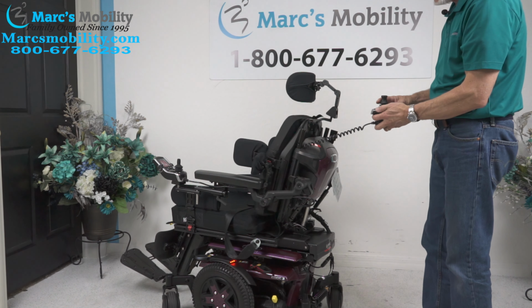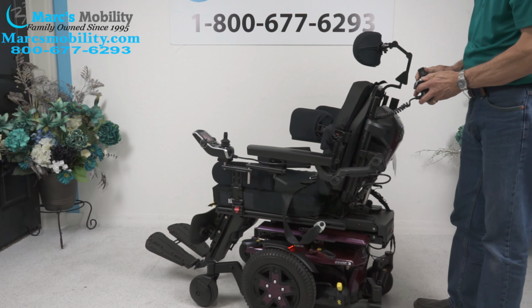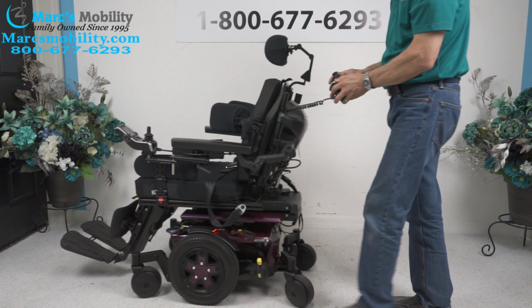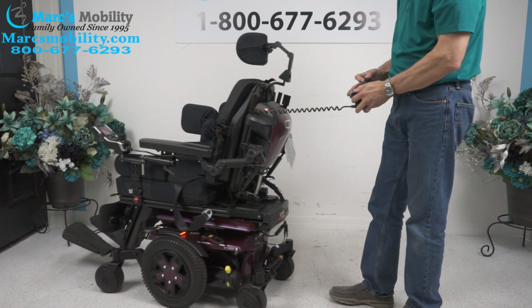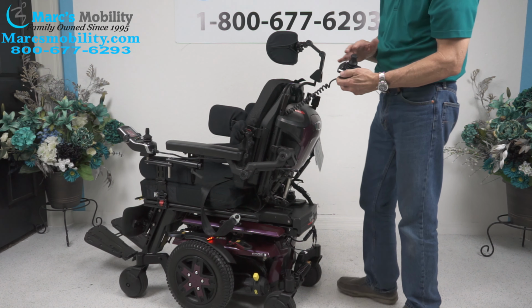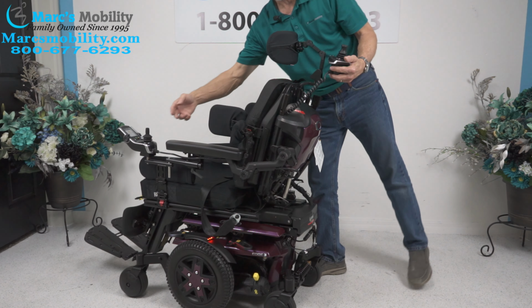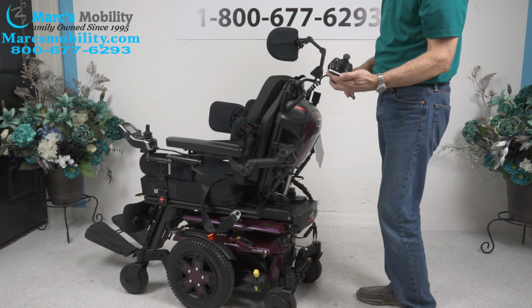Now I switched it over. I can drive this chair from here, just like you would do a remote car. And I can also do all the functions from here, the tilting, the seat lift, the tilt, and I can do all that from here. When this is operable, this one is non-operable. So you're not going to have two drivers ever. So this is called attendant control.